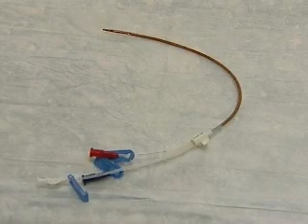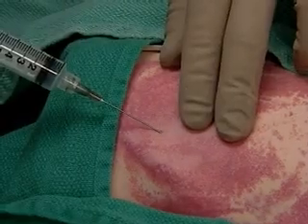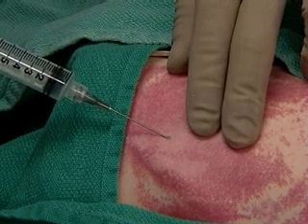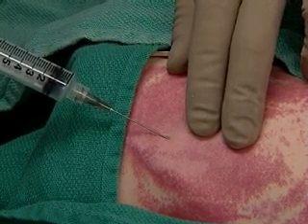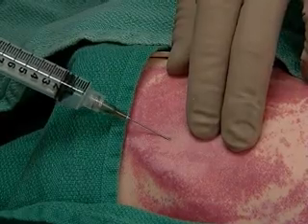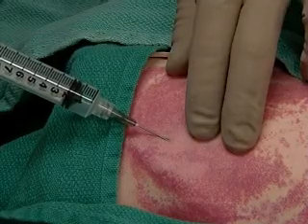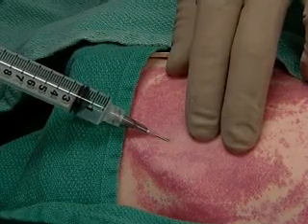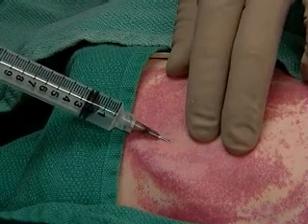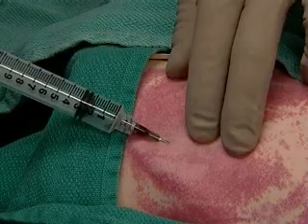This is the catheter — note the centimetre markings. Gently palpate the carotid and insert the finder needle at the apex of the triangle, advancing slowly and staying lateral to the carotid. The trickle of blood shows we're in the jugular.